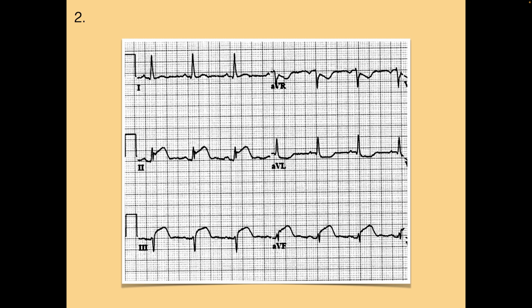2. And 3. And AVF. Yeah. So again, these are sort of slightly irritating J points where they're not nice sharp corners. But I think we can all see that it's somewhere here, so it's clearly elevated. This one is a little bit sharper, so we can see here there's almost 2. And then here, there is an R wave and an S wave, and the J point is right there. So we have three pretty solid.